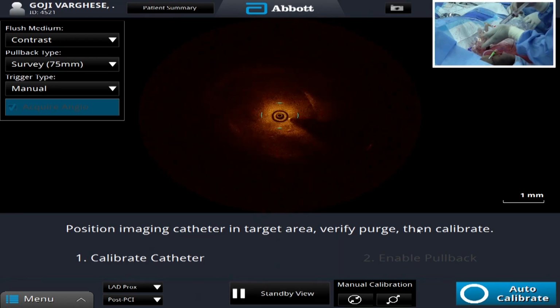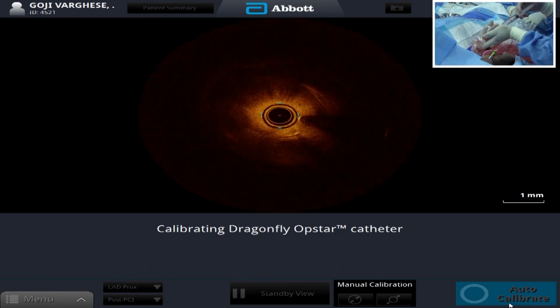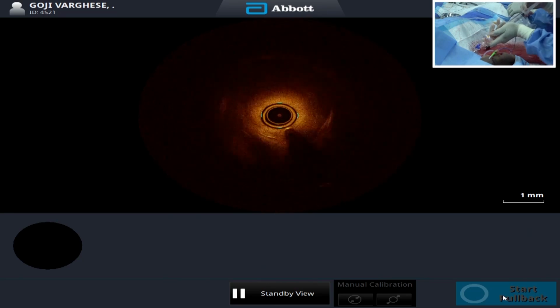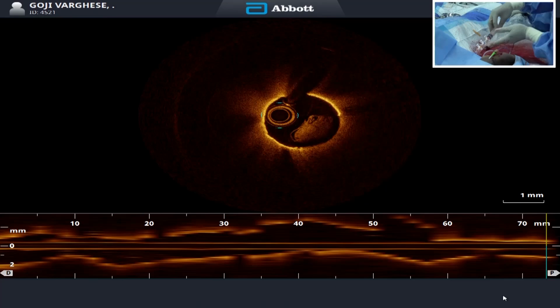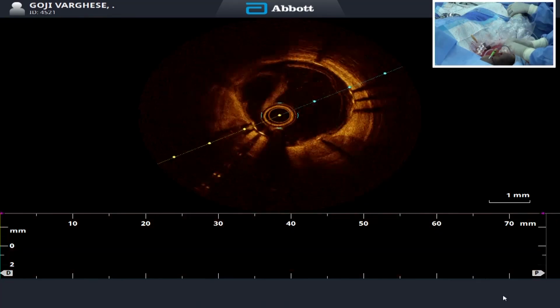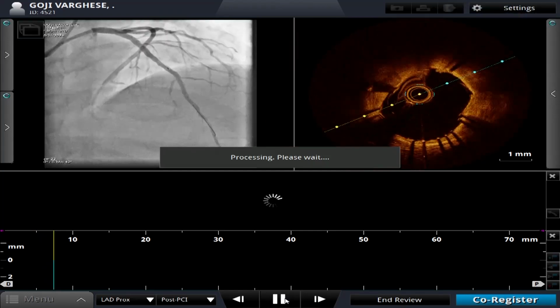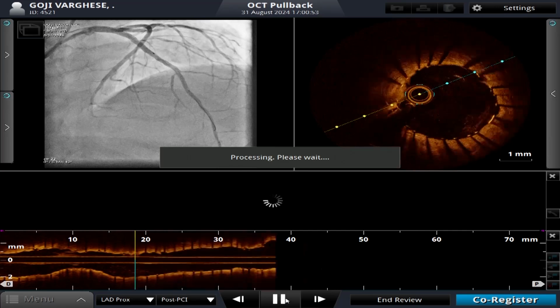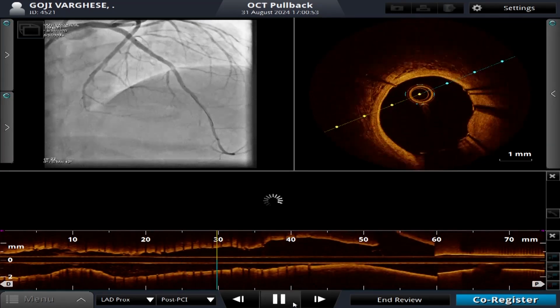Okay, Joel, you ready? Yes. Enable pullback, yes. Activate. Nitro. Show, yeah, show the proximal.